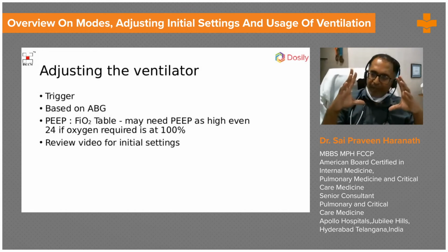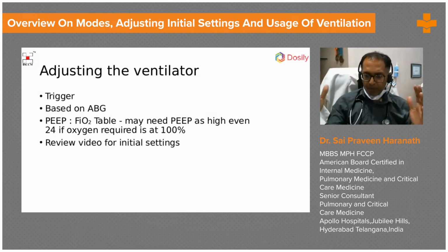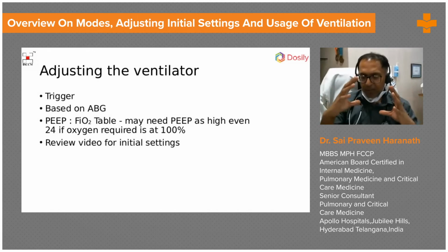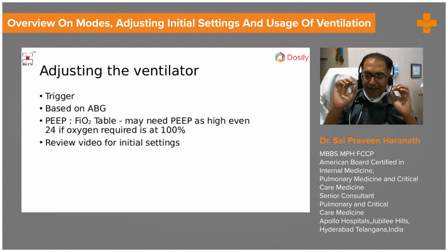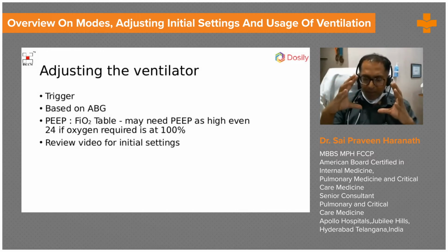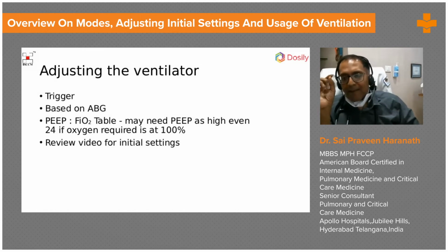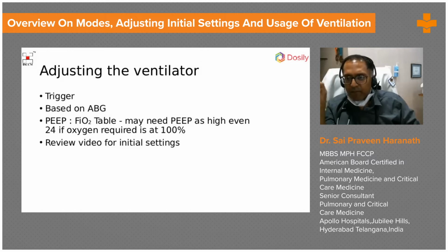I'll quickly touch on the concept of PEEP, and then we'll move on to the video. So PEEP is essentially where you're blowing the lung open. Remember the balloon example? We blew the balloon open. Once you blow the balloon open, you have to keep the balloon inflated. In order to keep the balloon inflated, you have to continue to keep pushing air in. And that is where it is called positive end expiratory pressure. Inhalation, exhalation, but you don't want the lung to fully collapse. You don't want the balloon to collapse. In order to ensure that, you have to continue to keep giving a little bit of air in. And that is the concept of the positive end expiratory pressure, or PEEP.